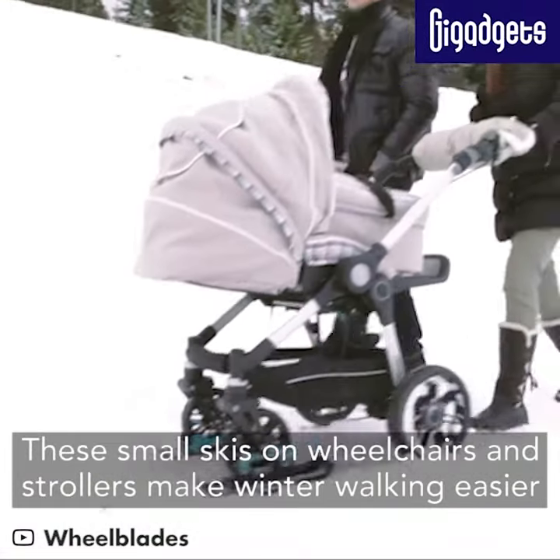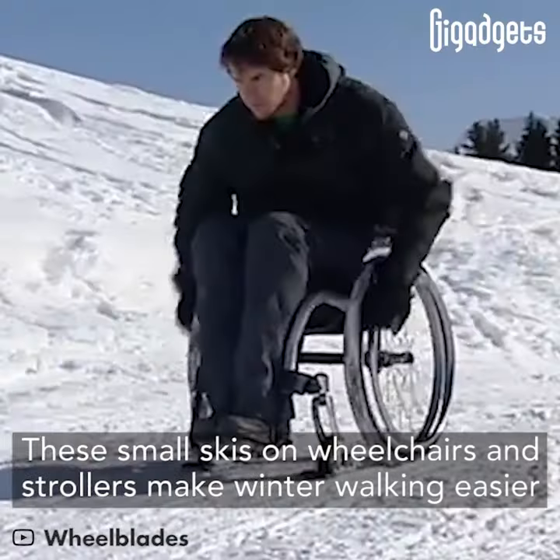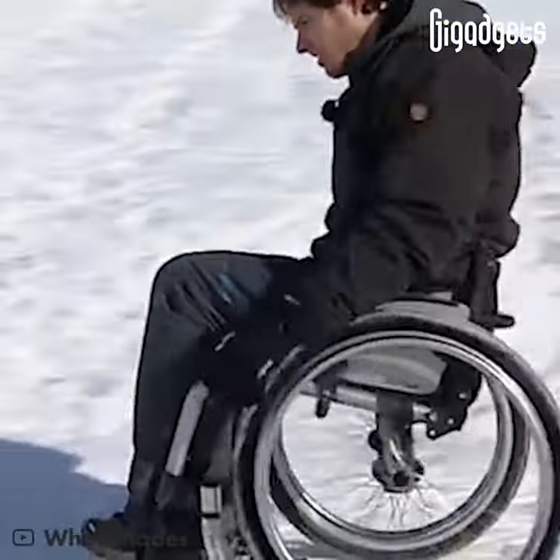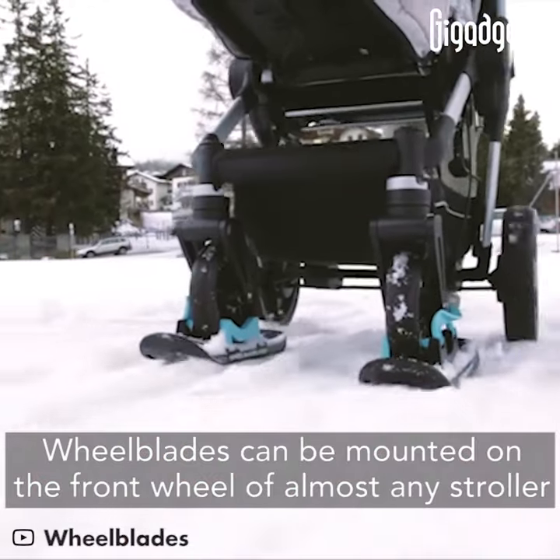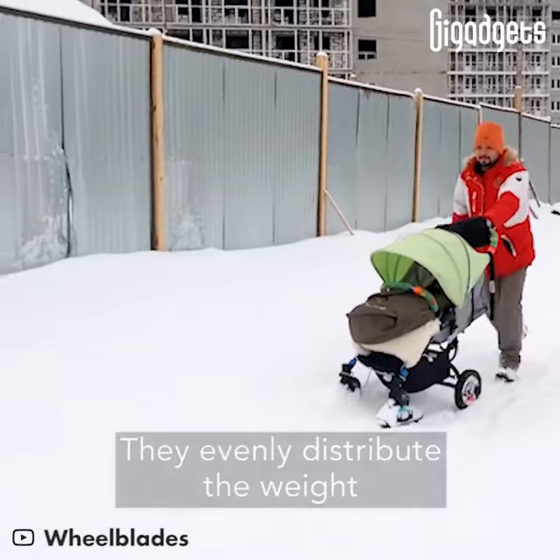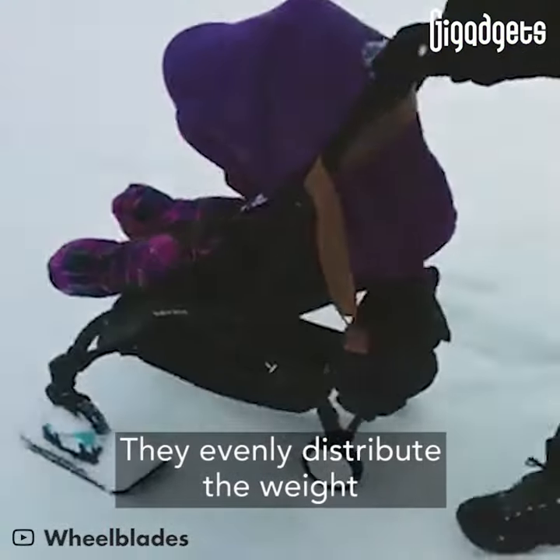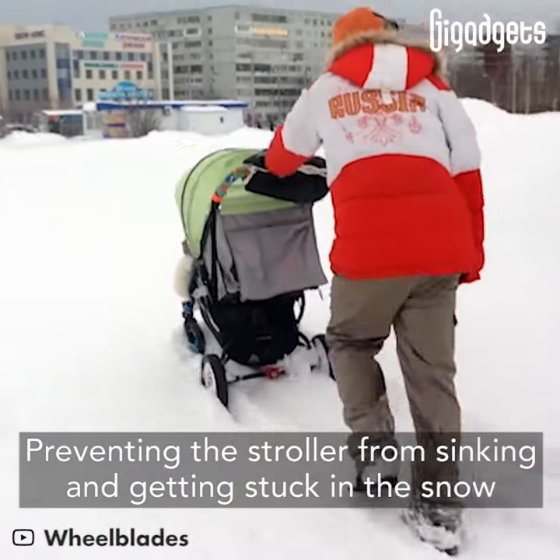These small skis on wheelchairs and strollers make winter walking easier. Wheel blades can be mounted on the front wheel of almost any stroller. They evenly distribute the weight, preventing the stroller from sinking and getting stuck in the snow.